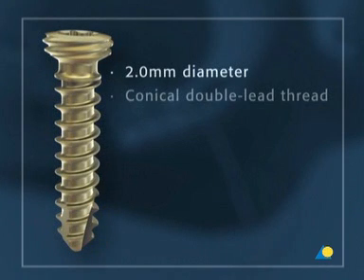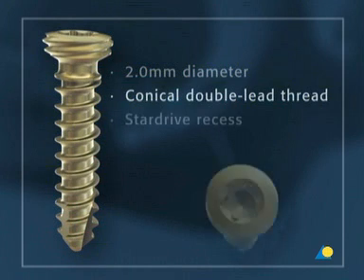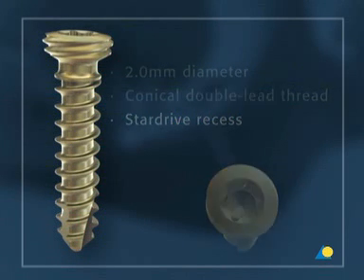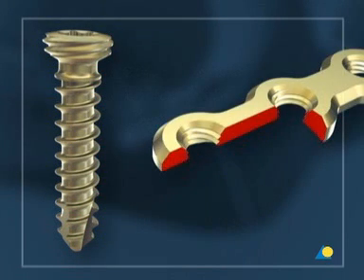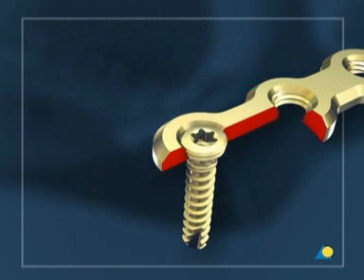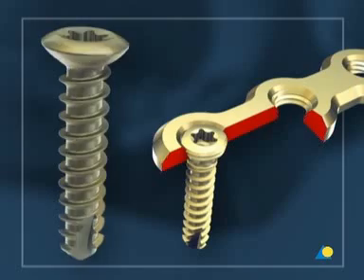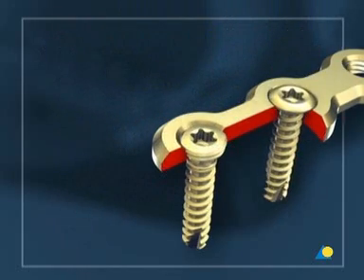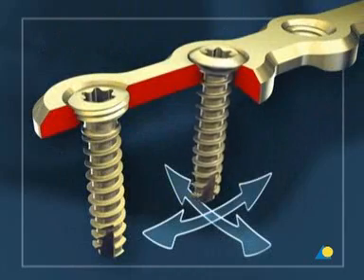The two-millimeter locking screw has a threaded screw head. In this exercise, a screw with a star-drive recess is used, although a cruciform version is available. The locking plate has a corresponding threaded plate hole. During insertion, the locking screw engages and locks into the threaded plate hole. If necessary, the threaded plate hole also accepts non-locking screws which permit greater angulation.